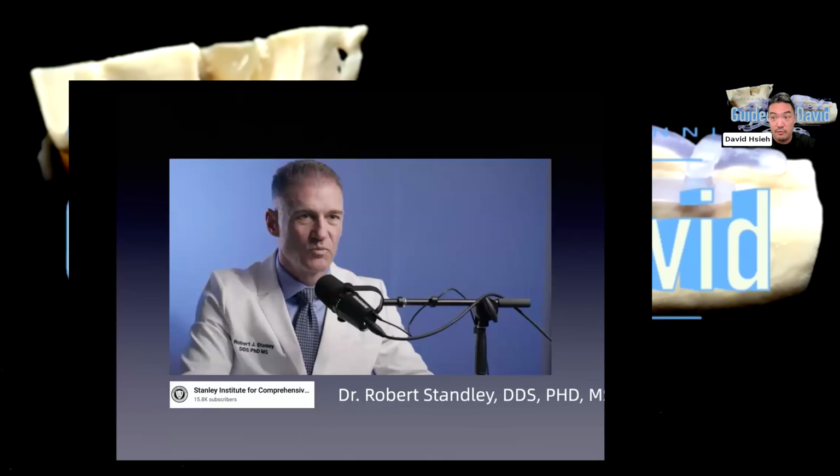And then I would love to run this video for you. He's a pretty famous doctor, Dr. Robert Stanley. He talks about what he found in his daily work, and I would love you guys to hear that as well.